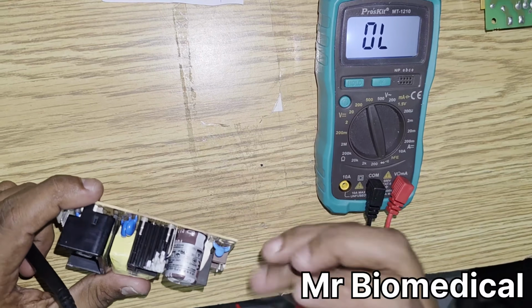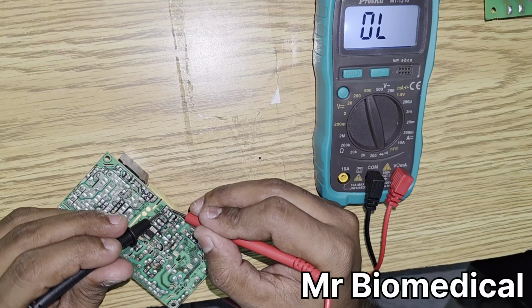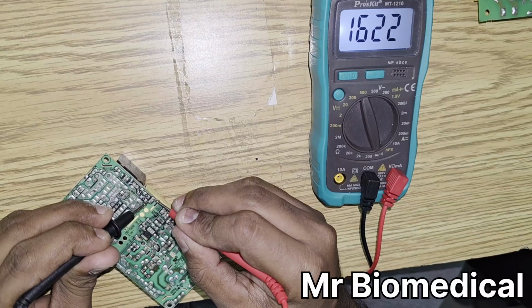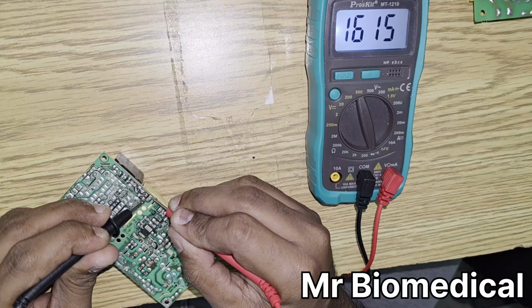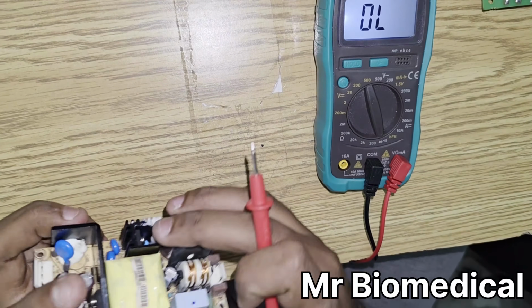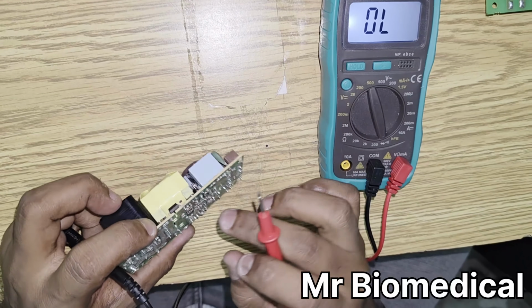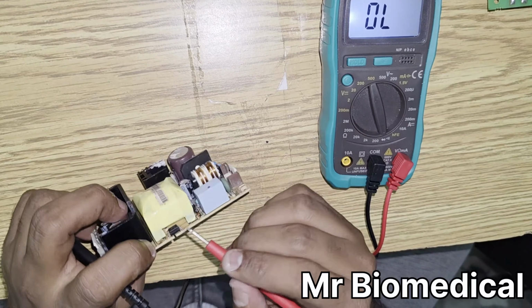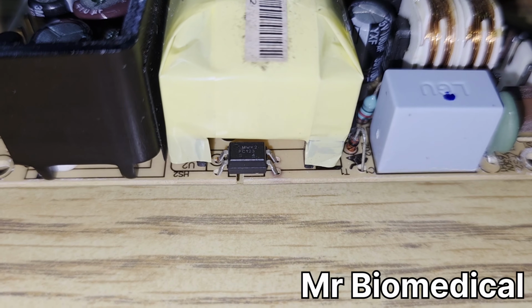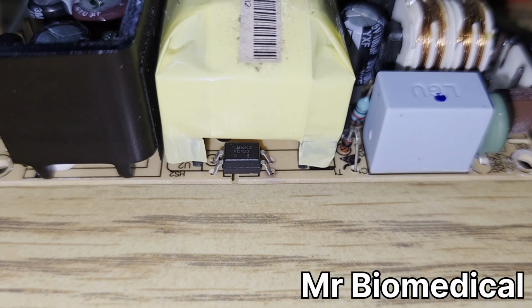Then the most important thing is the optocoupler, which is here. You can check the optocoupler. This one can't be like this, because it should not show any values. It might be a PC817, because I think mostly they are using PC817. So I will desolder this one and put a new one, and we will see whether the output will come here or not. This optocoupler is PC123, but I think we can replace it with PC817.